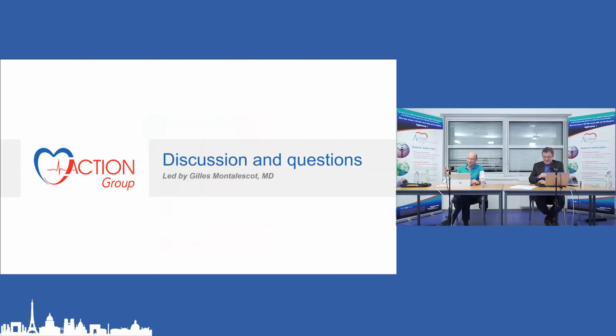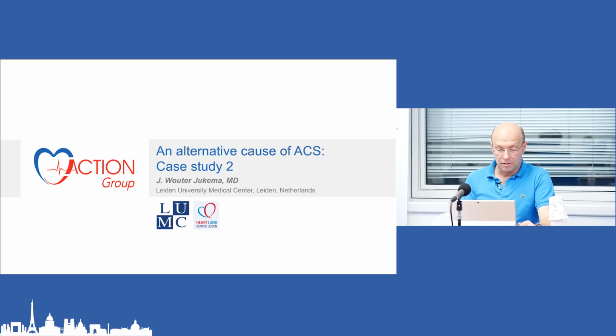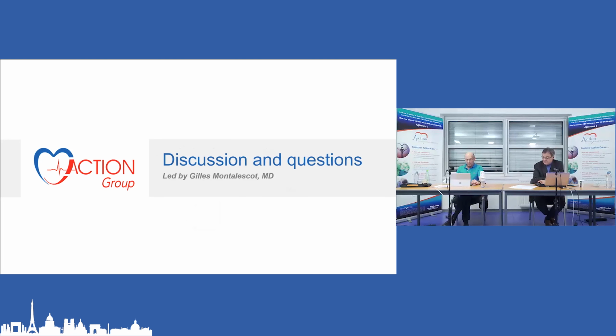Of course, rotablator is part of the cath lab. I could not address all the essential tools, but I think that rotablator is about 3 to 5% of our procedures. And of course, they are essential tools. We do not need randomized studies to show the benefit of this type of device. The only concern is that you need to be trained to use it for the right patient in the right lesions. But it's, of course, an essential tool, and this is a very good question.